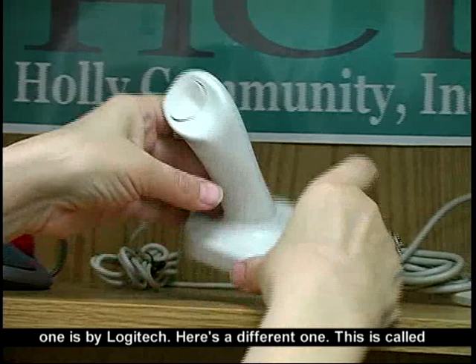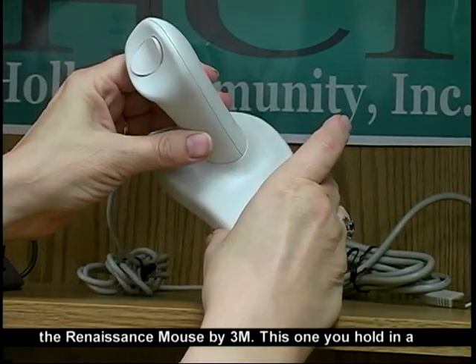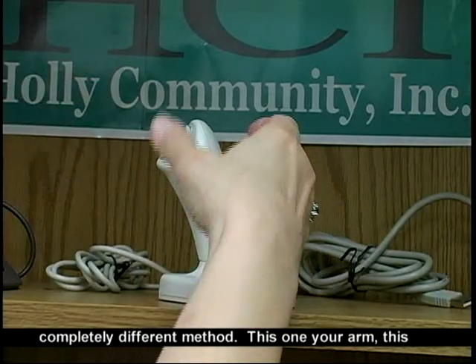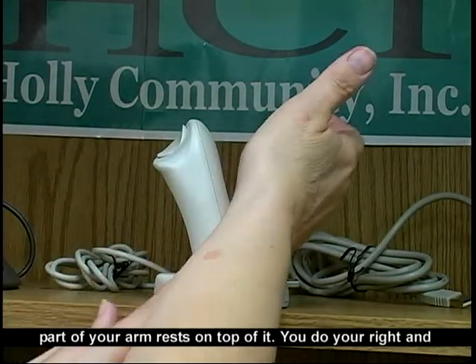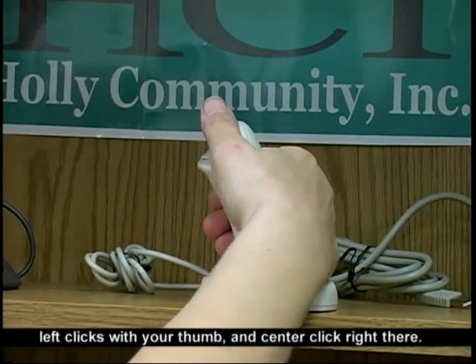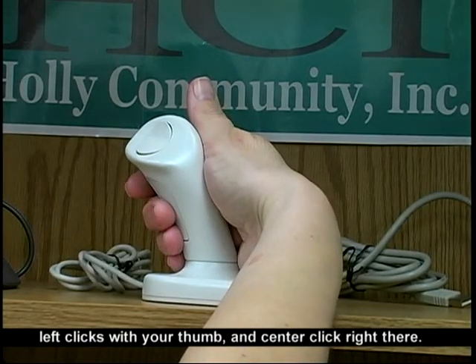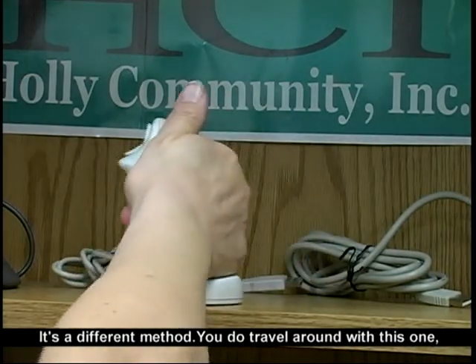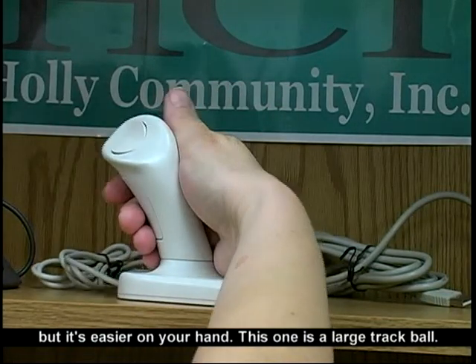Here's a different one. This is called the Renaissance Mouse by 3M. This one you hold in a completely different method — this part of your arm rests right on top of it. You do your right and your left click with your thumb, and a center click right there. It's a different method. You do travel around with this one, but it's easier on your hand.